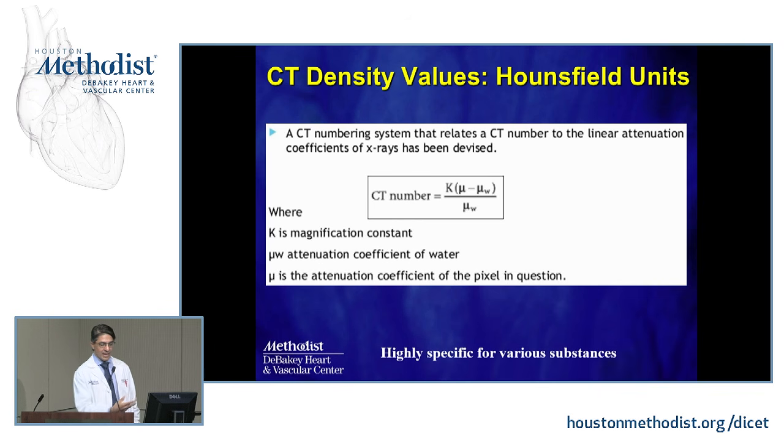This is then converted through a formula into a CT density value, or Hounsfield unit, which you are very familiar with.